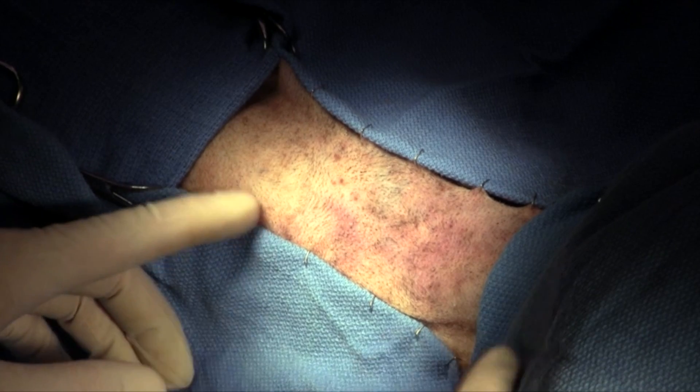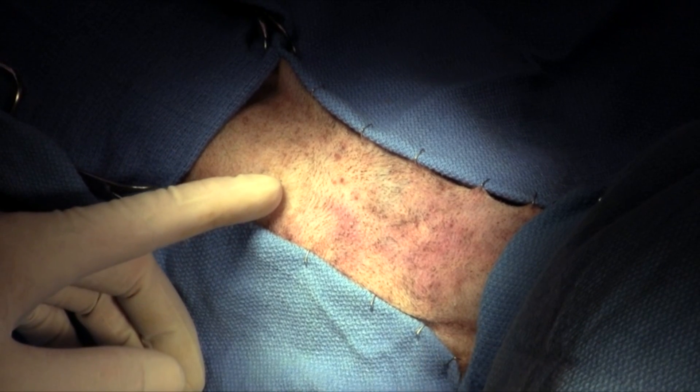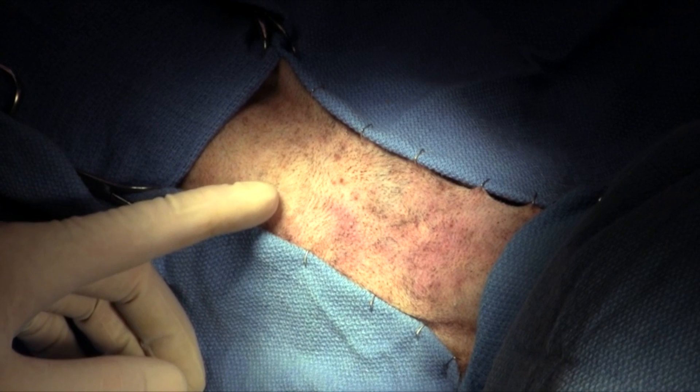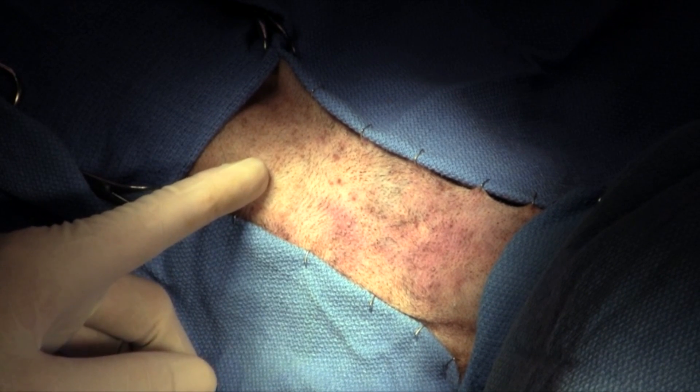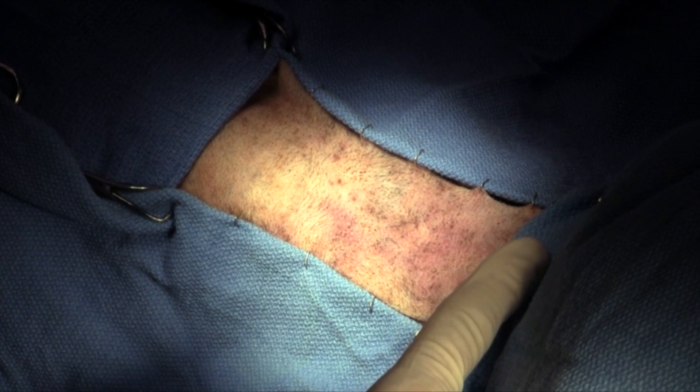In those tracheotomy tubes without an inner cannula, such as the one demonstrated here, tracheotomy tube care must come from frequent suctioning and installation of saline through the tube. The dog has been placed in dorsal recumbency. The larynx and the manubrium of the sternum are indicated.